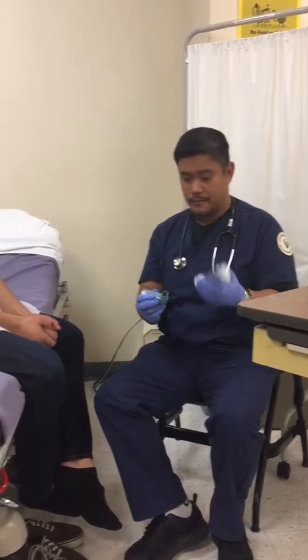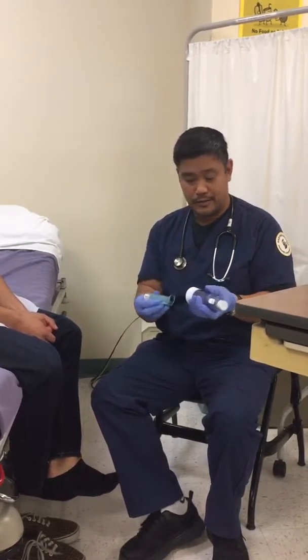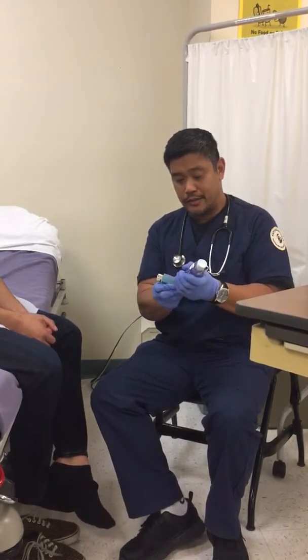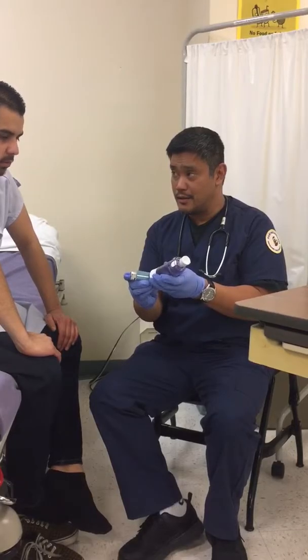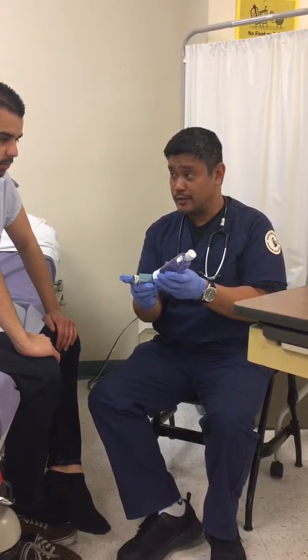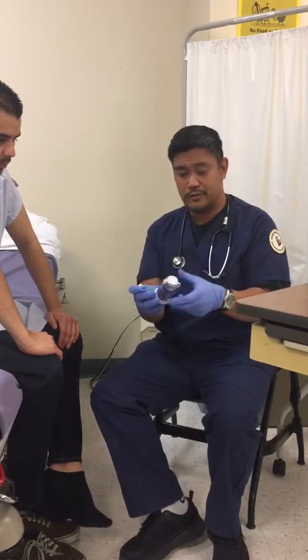Ideally, you're going to want to use this with your spacer. The spacer basically holds your medication in this little chamber right over here. So you just go ahead and insert that inside here. And when you're ready, you go ahead and hit the actuated device once. It'll basically hold your medication right there, ready for you to use.